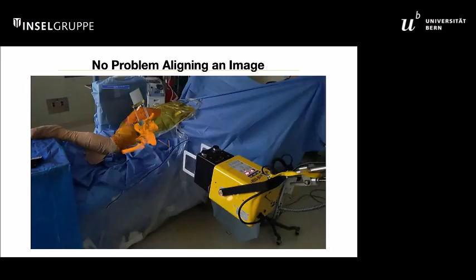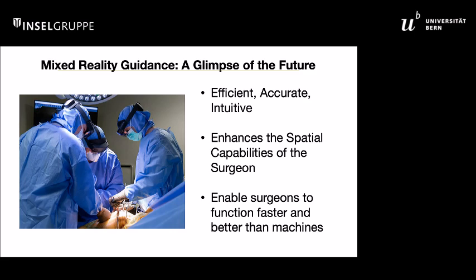So another fun thing, if you want to get intraoperative x-rays, you can display the coordinate systems in space, both functional and anatomic coordinate systems, both supine or in the lateral position. So if you want to get an x-ray, you can see exactly where the patient is, and you can line the patient up perfectly and line up the x-ray beam and get the correct x-ray right from the start, because you know what it's going to look like before you take it, and you never have to get an x-ray from the wrong angle.